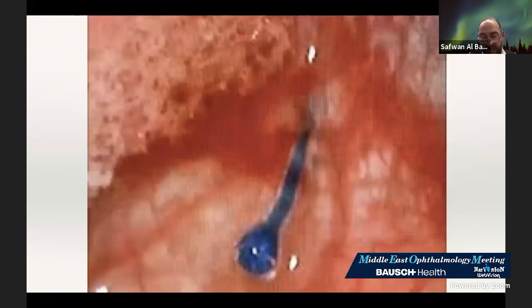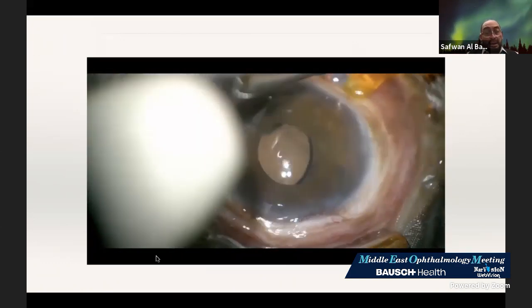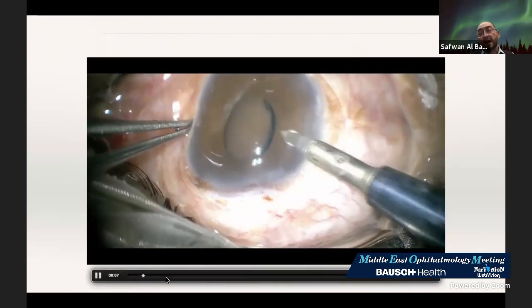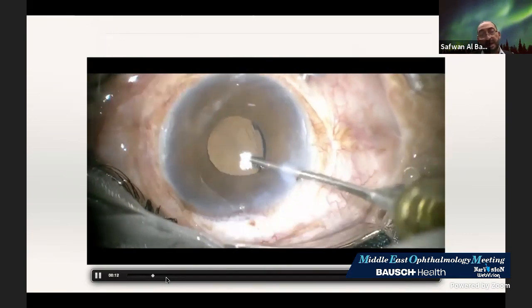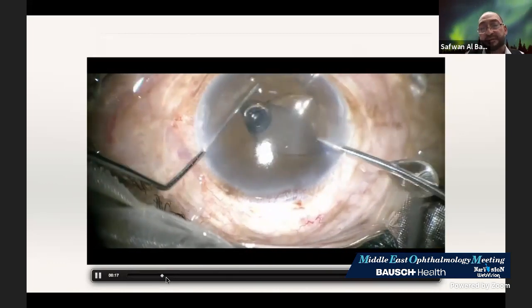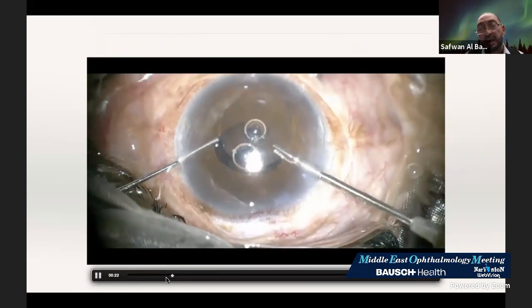Now I will go to the hinge. I will go to the movie without double needle. Now this lens is in, and I decided to save that lens and rescue that lens, and that's the movie, how it works. Here I'm doing the paracentesis. The marker, the lens, I get it up, and it wasn't prepared for the record, so I'm just releasing the haptics from the bag, and then releasing the trailing haptics.